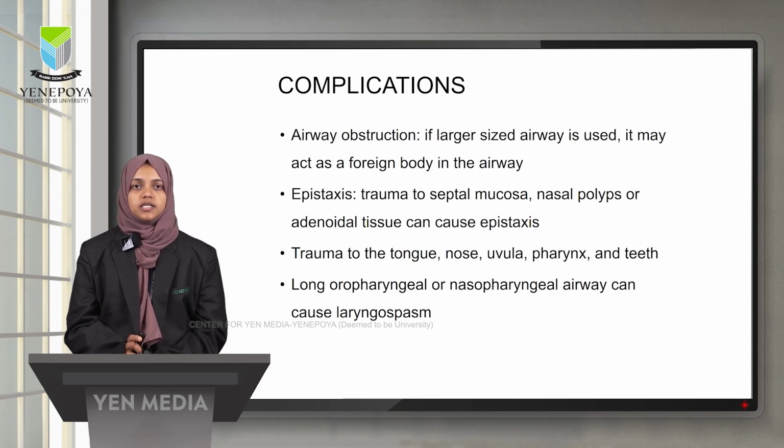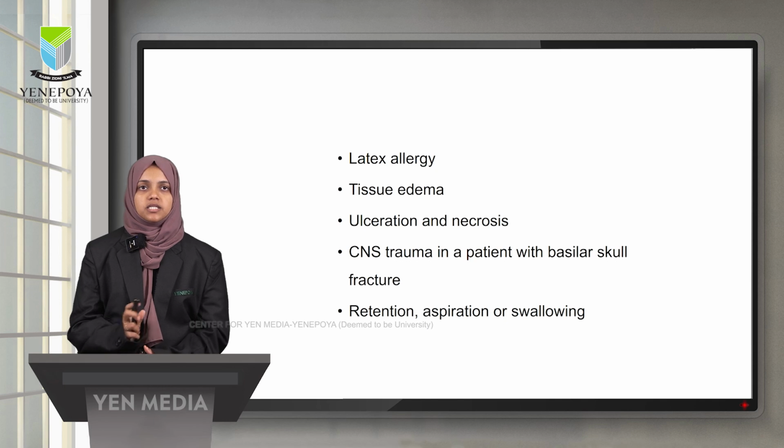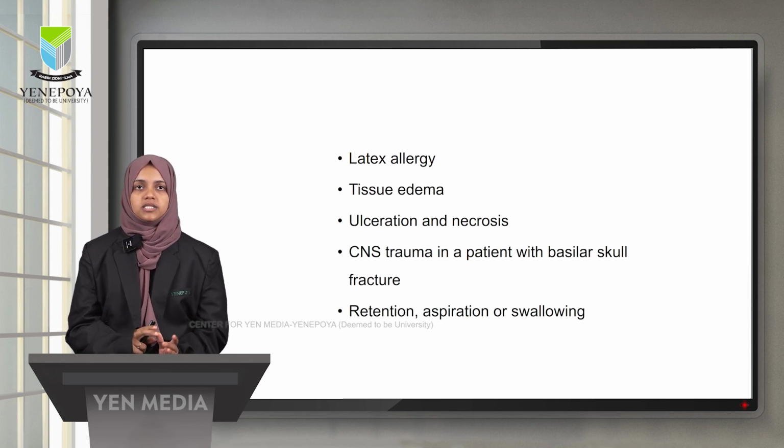A long oropharyngeal or nasopharyngeal airway can cause laryngospasm also. Before inserting, we have to make sure that the patient is not allergic to latex materials. In that case, patients can develop a latex allergy. Another is tissue edema, ulcers and necrosis can happen.